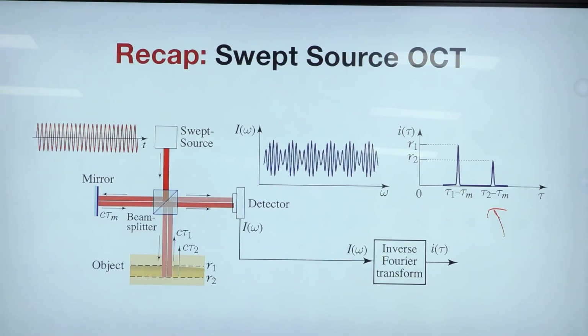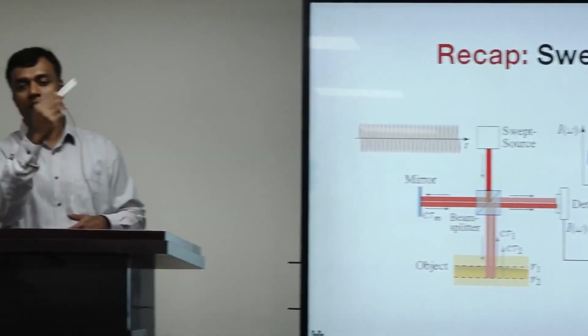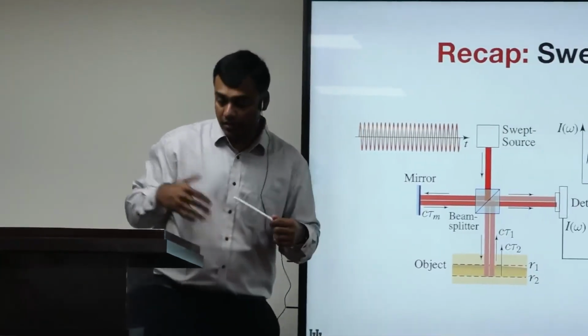So it's a side viewing architecture. For several organs where it's a tubular, cylindrical structure, you need to look to the side and do a rotational scan and move. So it will be a helical scan of the organ. So that's useful for some organs.